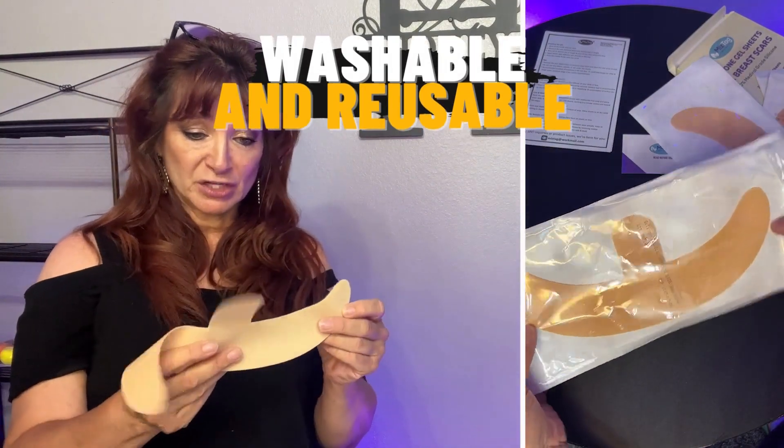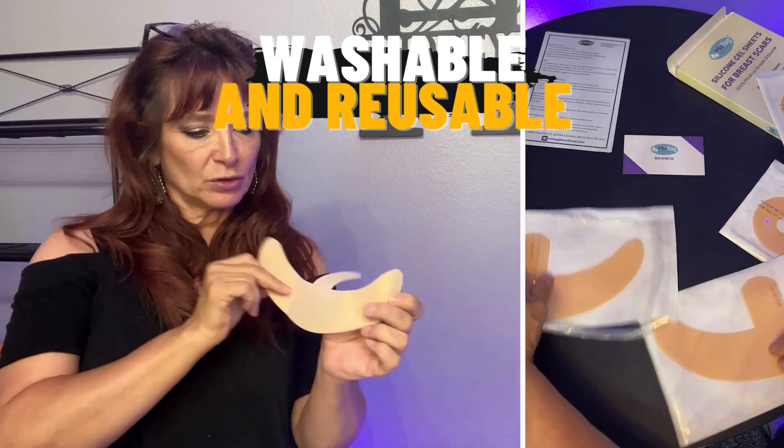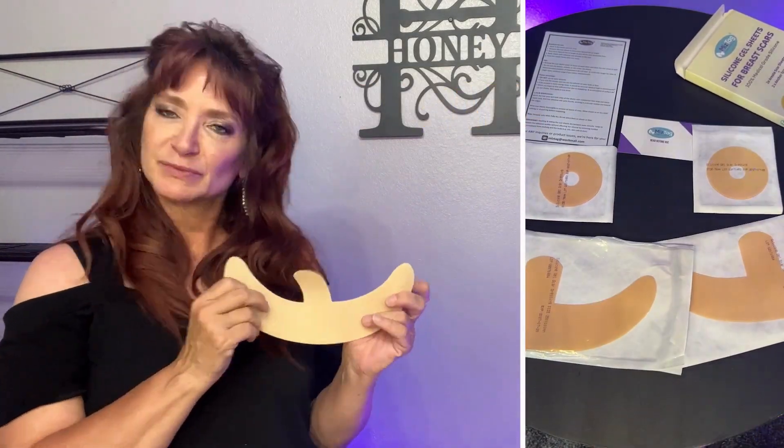I wish I had these when I was younger, but I'm gonna go ahead and check out my scars. My scars are nearly gone but I might try these out anyway to see if I can get a little bit better result. So very cool — thank you.